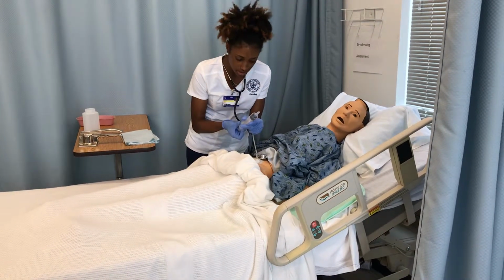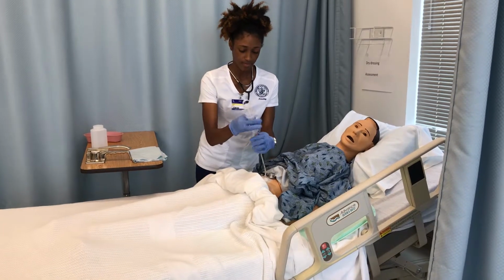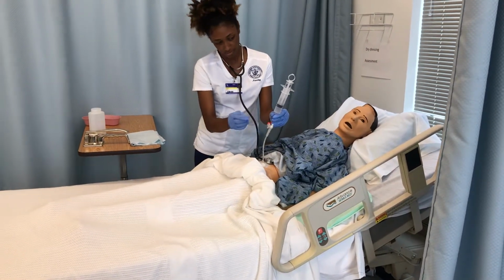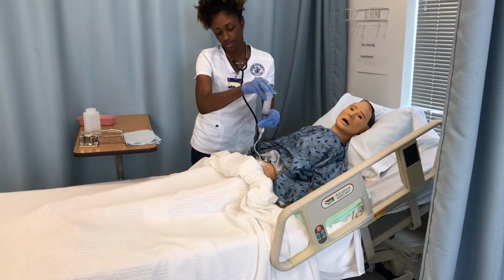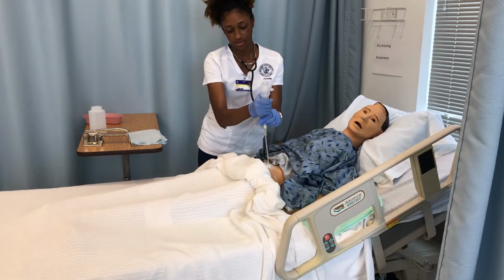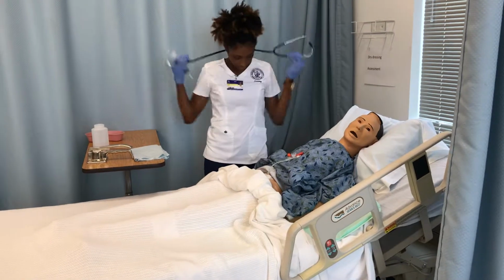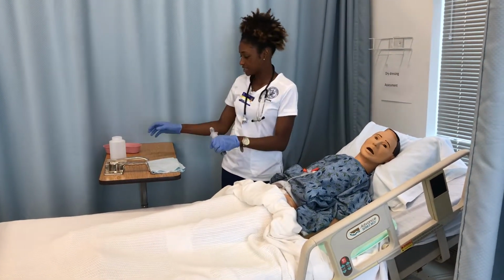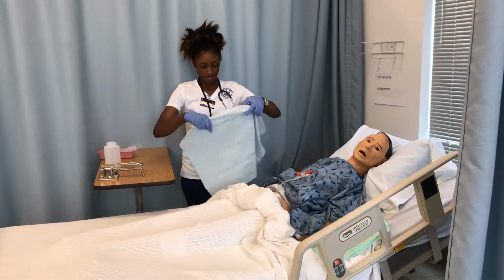I'll draw the syringe to 20 cc's. Open the valve. And then I'll listen for a swoosh, which I did here. So I'm going to close the valve. And then I'm going to aspirate gastric contents. So let me put my chuck down.